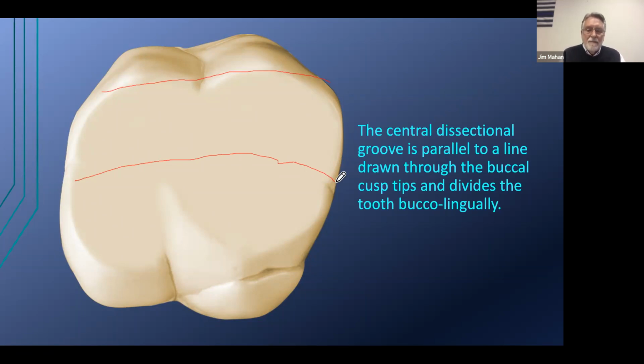There is a concept here that pits are the fundamental concept of a tooth. If you get the pits in the right place, there is a really good chance that everything else will be in the right place. But there's an unknown here, unless you have an opposing that you're going to tap on, and maybe it shows you where the opposing teeth are, and you say, okay, well, the pits are here. How do you know exactly where the pits are located?